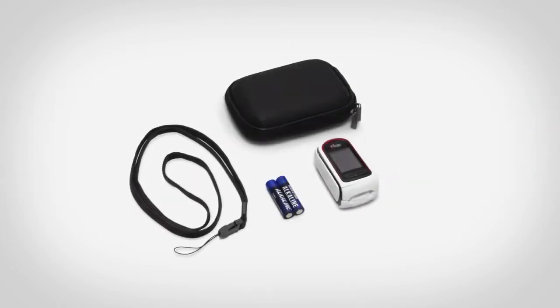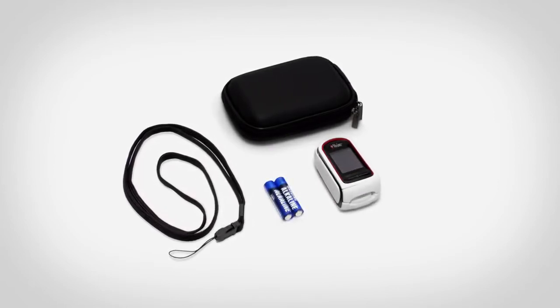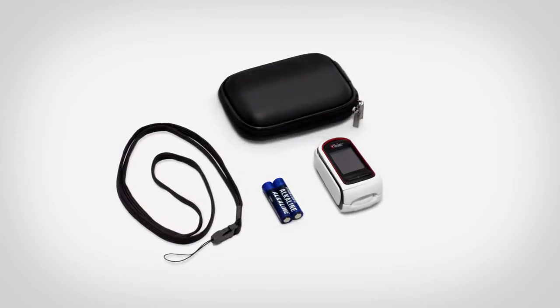The MightySatRx kit includes one MightySatRx device, two AAA alkaline batteries, one lanyard, and one carrying case.